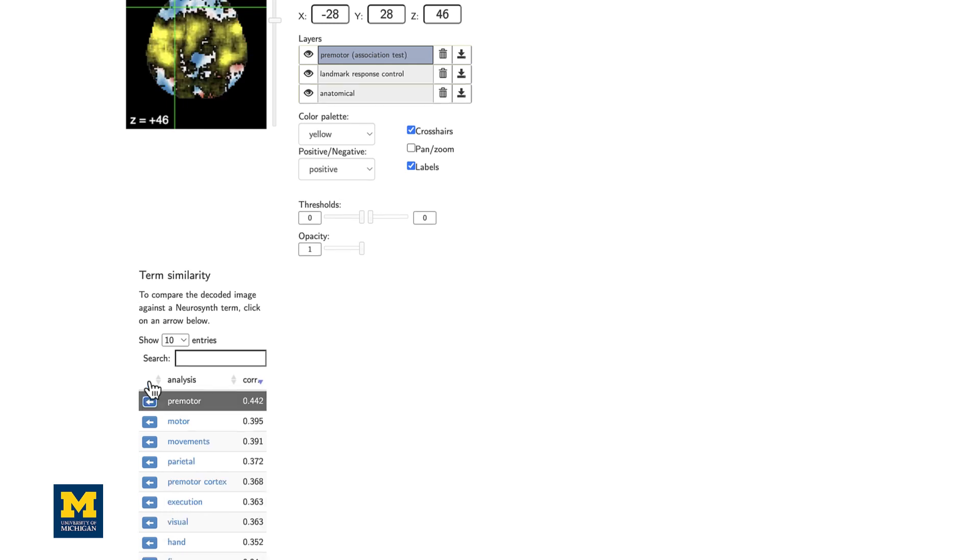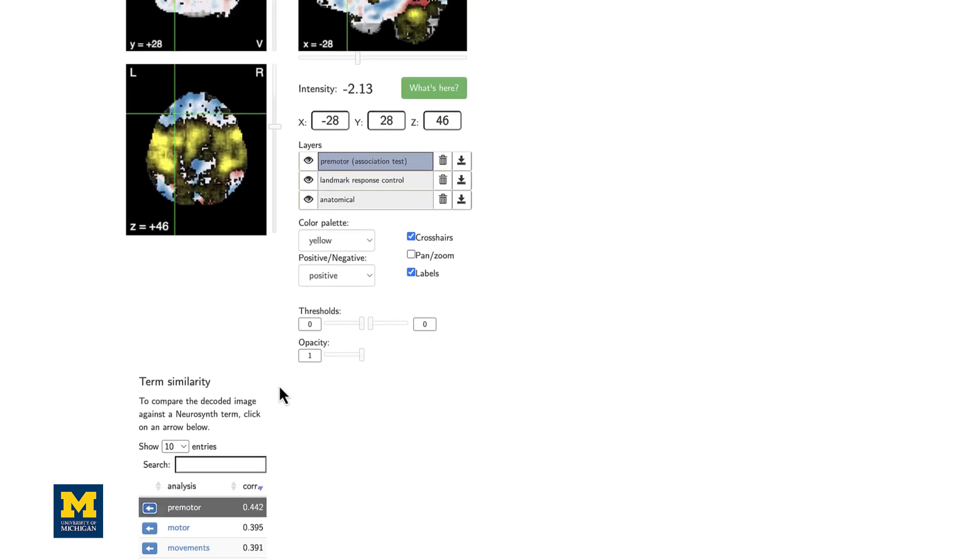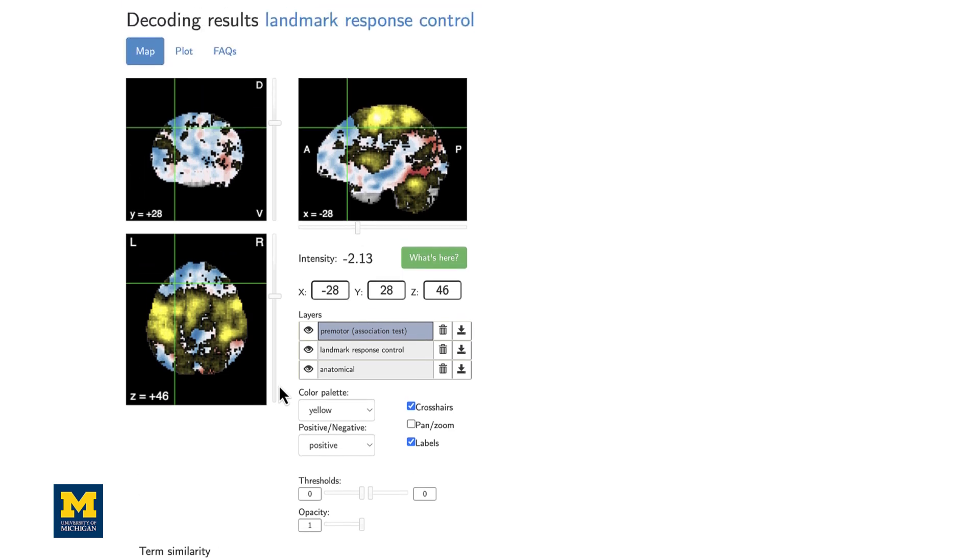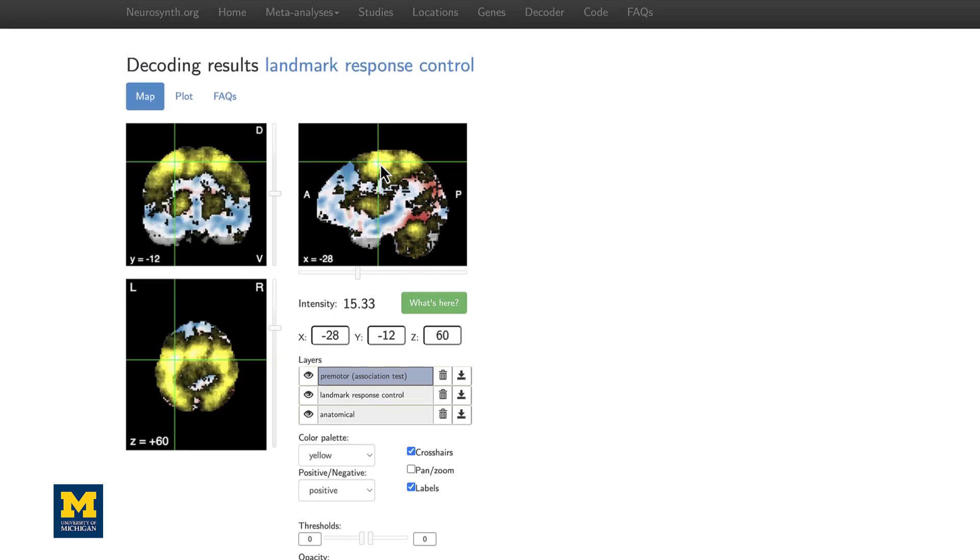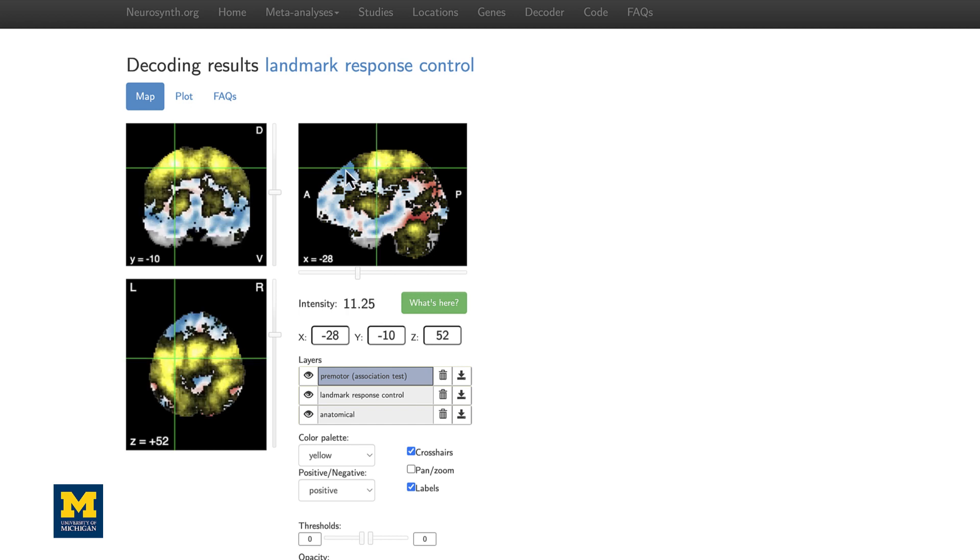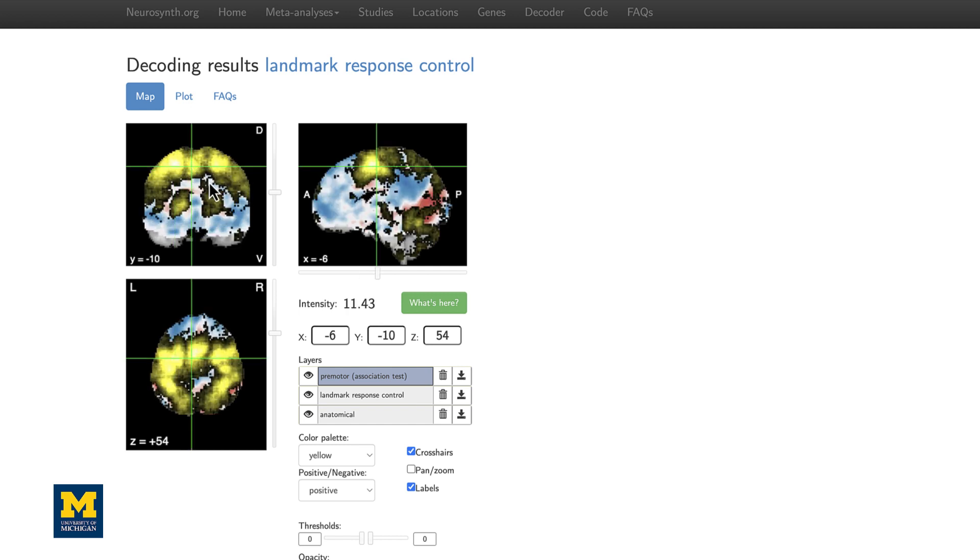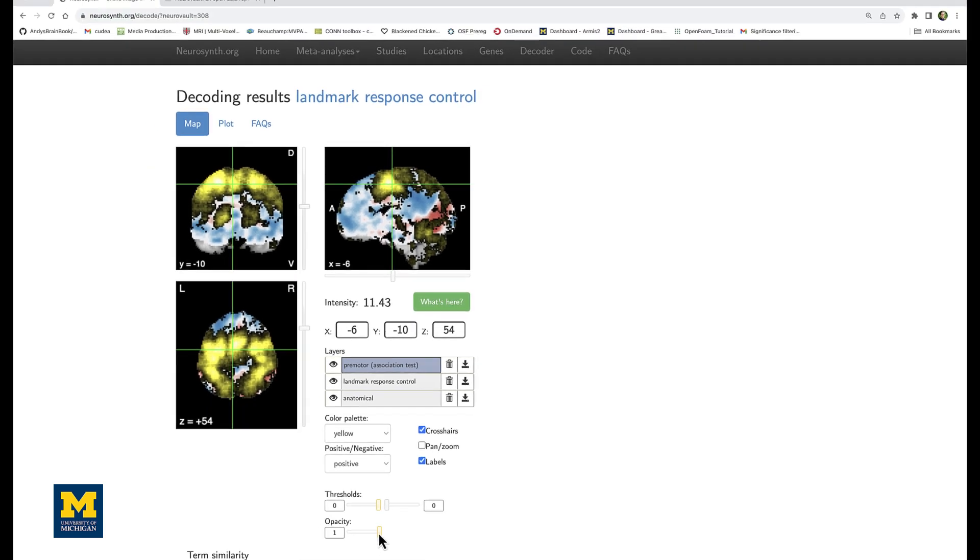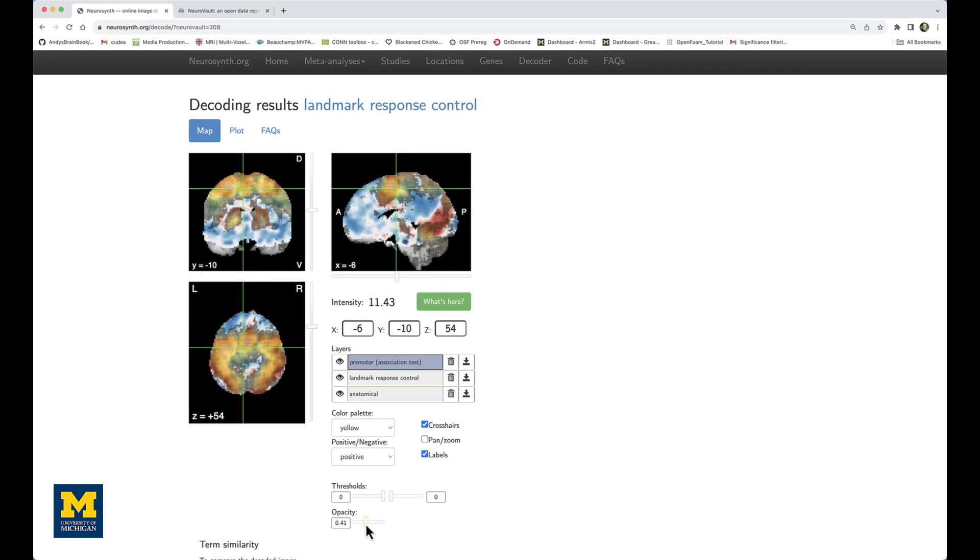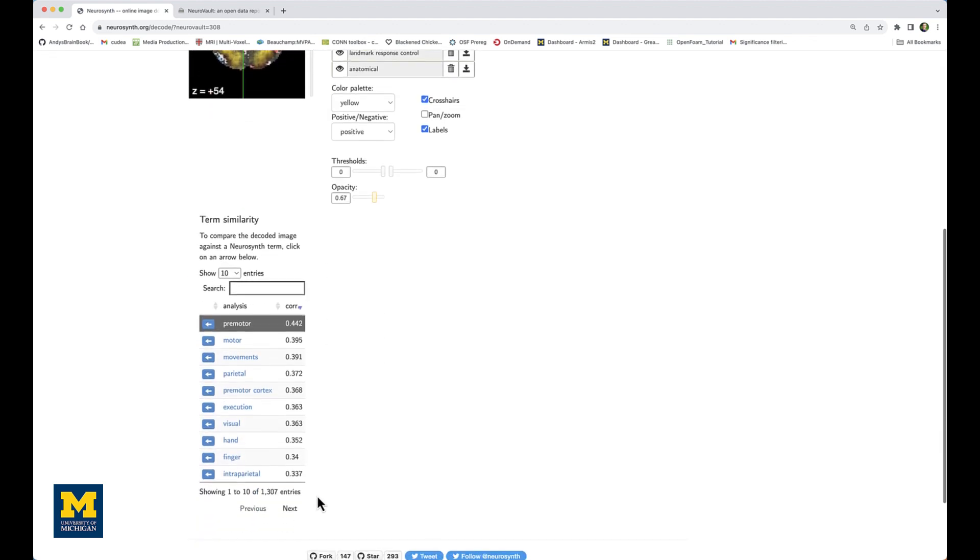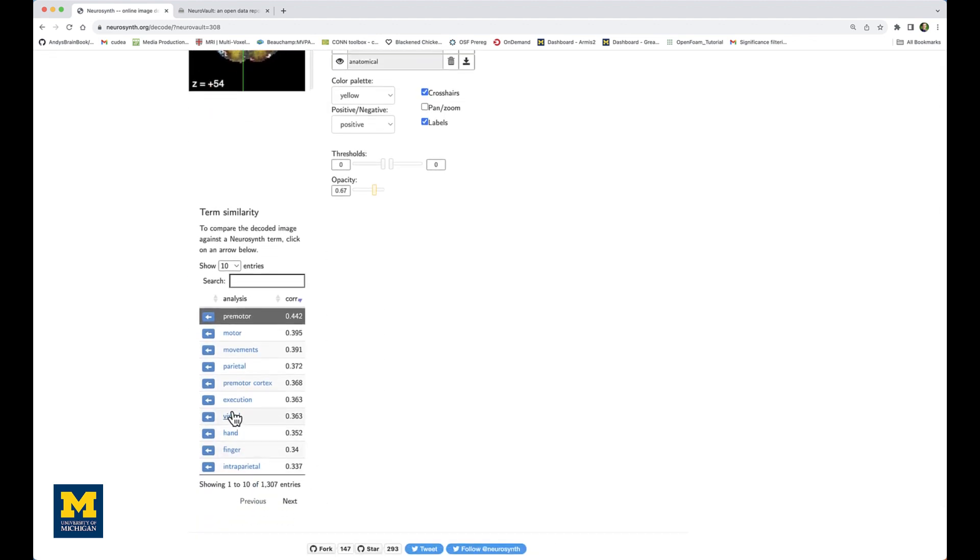If you click on the arrow button next to, say, premotor, this will overlay the meta-analysis map for the premotor term, which includes a high degree of active voxels in places like the premotor area and intraparietal sulcus. You can adjust the opacity to see how well the positive voxels overlap with the positive voxels for the landmark response control map.